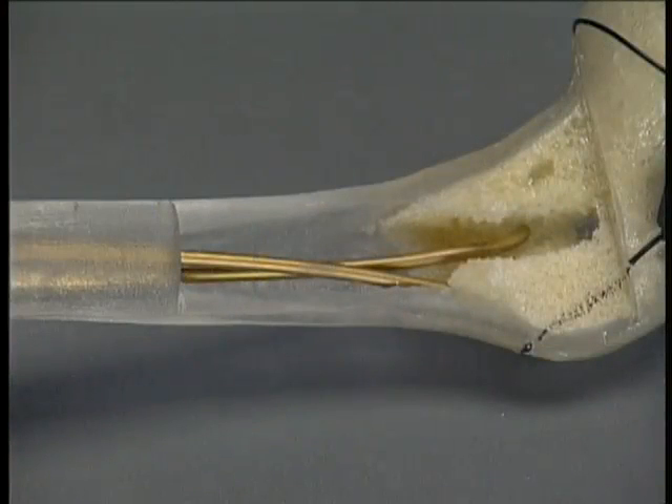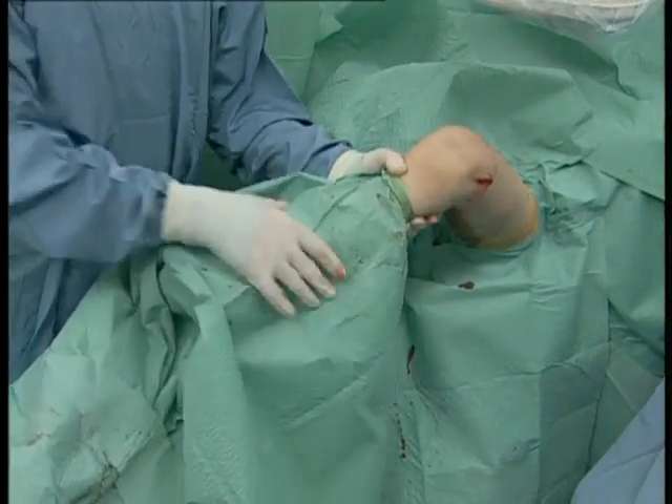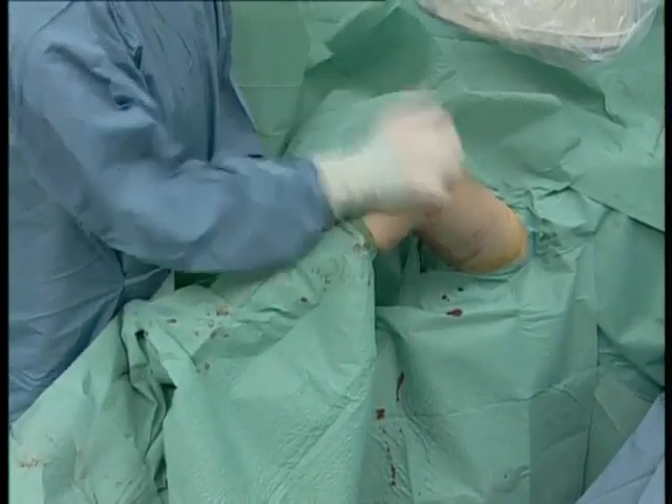Positioned in this way, the ends of the nails lie securely under the iliotibial tract and allow free movement of the knee. Correct anchorage of the tips in the metaphysis is essential for perfect stability. It is recommended, especially with oblique fractures, to check stability by axial blows against the knee and to avoid distraction. The ends of the nails must not become loose.